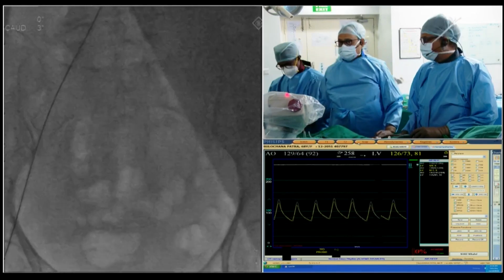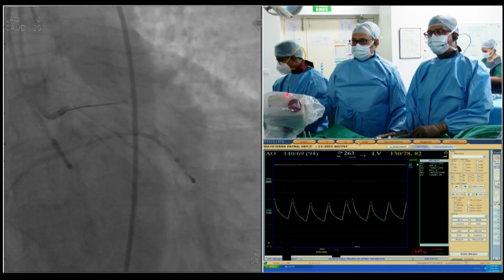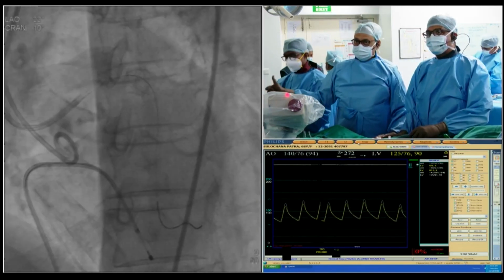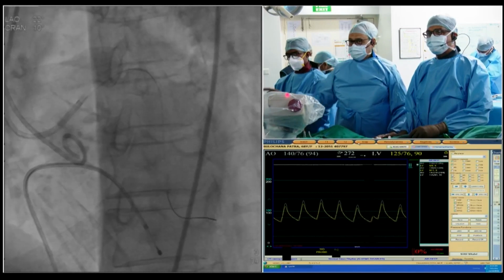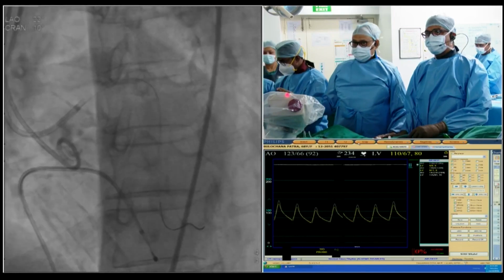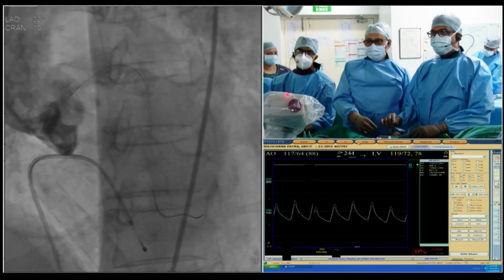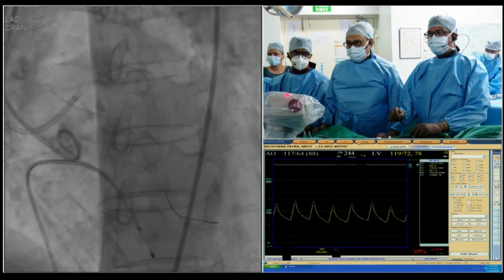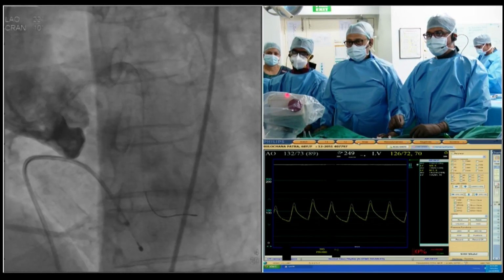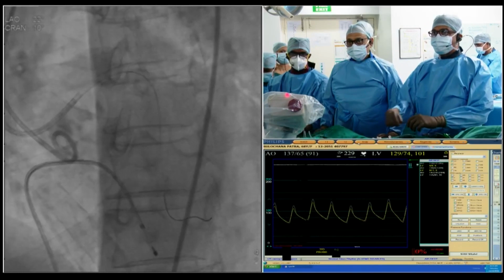Next. So we protected the femoral arterial access you saw. Now we're protecting the coronary artery on the left side. And then we take the next picture. We'll take an aortogram. As you can see, the venous access is from the left femoral. There's a pacemaker from the left femoral, and pigtail from the left femoral artery, and EBU 3.0 guide from the right radial, and run-through wire shot in the LAD. And here in this view, it looks like the right coronary height also is low.